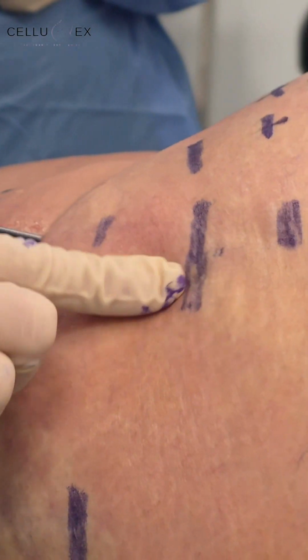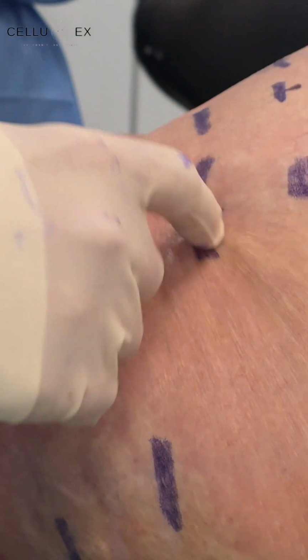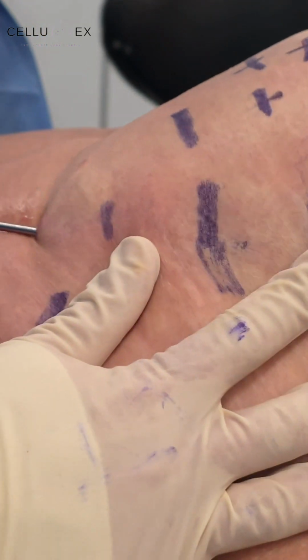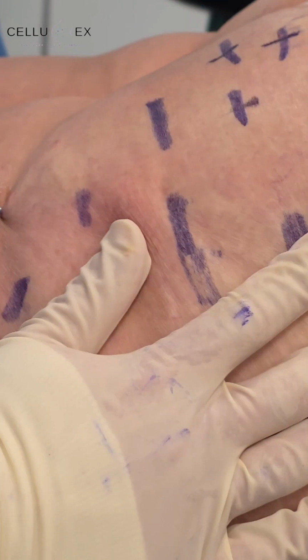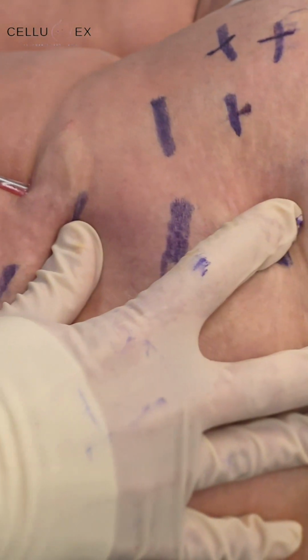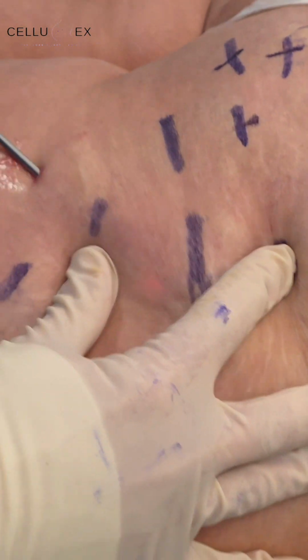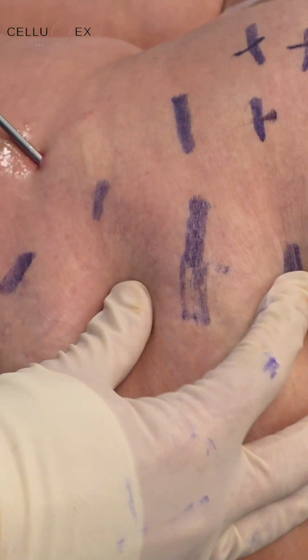I'll go to the next one here with the light source. Pull it, you see the skin tethering. Now I'm gonna cut it. Then you go a little bit up. You release it. You try to release the septum fully. Do not go too superficial. Work a bit deeper.